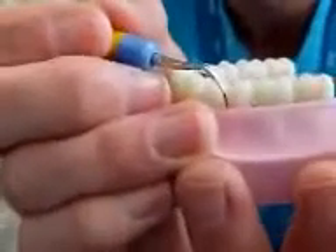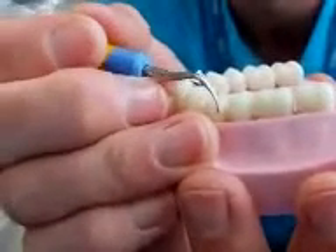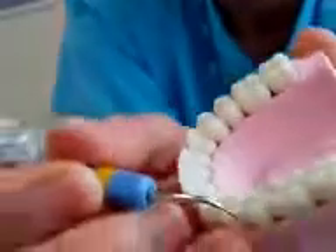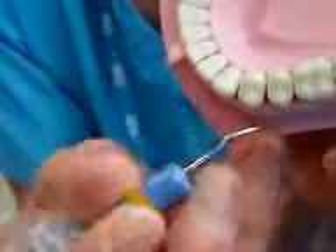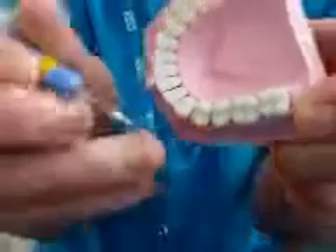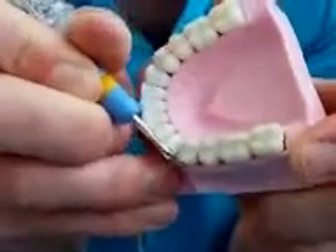Remember what I said: this instrument vibrates, and it cleans more effectively in a forward-backward motion than it does in a sideways motion. So what that means is, on a tooth surface, you want to be coming in side-on — not like this.